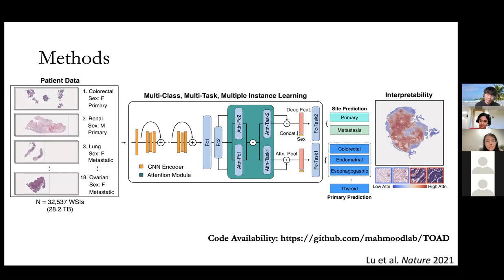There's probably a primary morphology that's very characteristic and appears in like 90% of the cases, but there might be another morphology that's only present in like 10% of the cases. Sometimes both morphologies can coexist in the same slide. So depending on how large your training set is, the model might find it convenient to think, from a frequency perspective, I just need to pick out that first type of morphology, right?